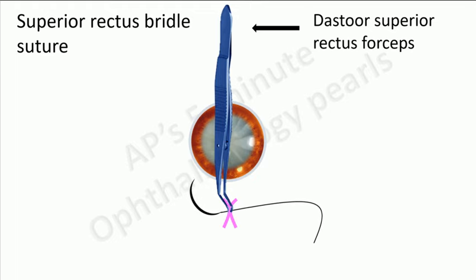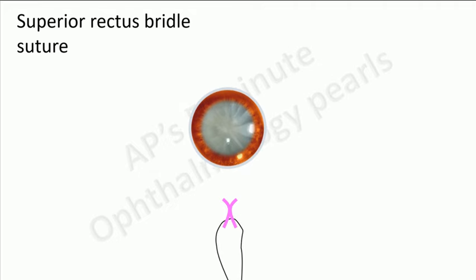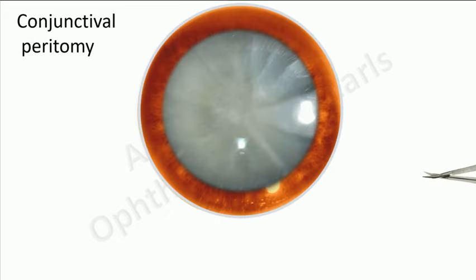A superior rectus bridle suture is applied while holding the superior rectus tendon with a Dastoor superior rectus forceps, so as to turn the eyeball slightly inferiorly to maximize surgical exposure.